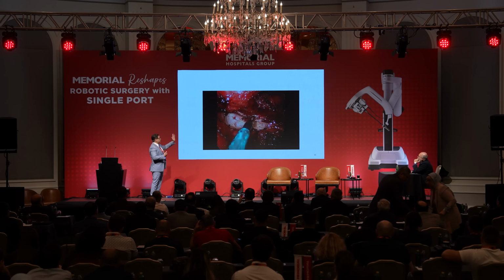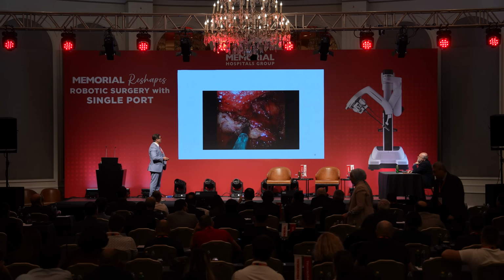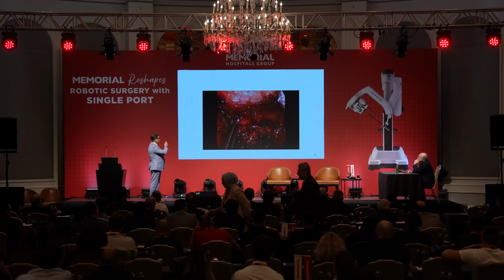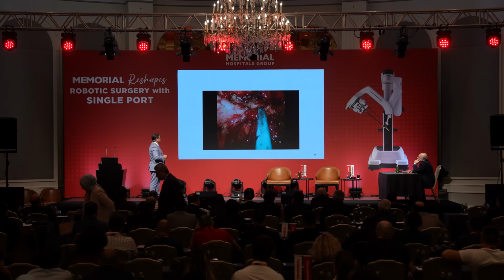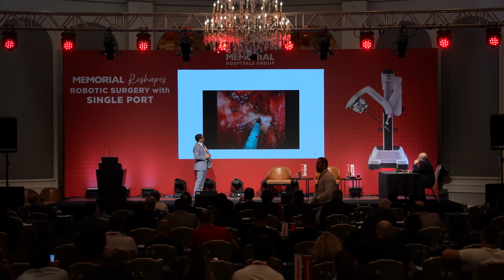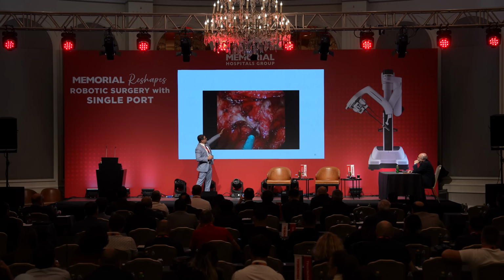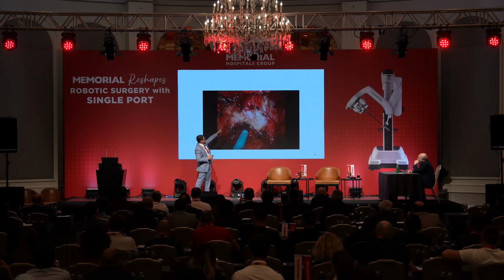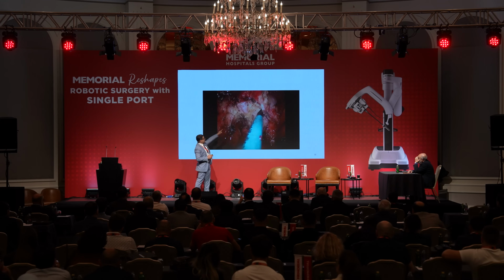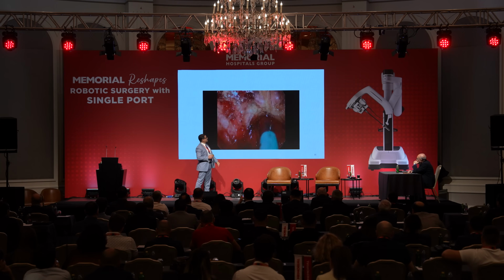Here I am taking the lateral stalks. This is the right patient side lateral stalk. And you can see these are all neurovascular bundles and nerves. And now you can see I'm curving medially. And you can see the seminal vesicles and the vas is there. And then I already cut the peritoneal reflection anteriorly.